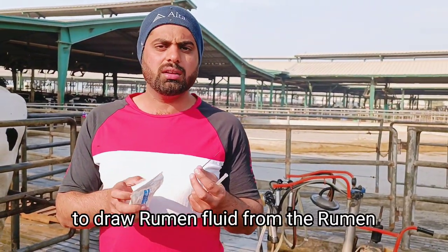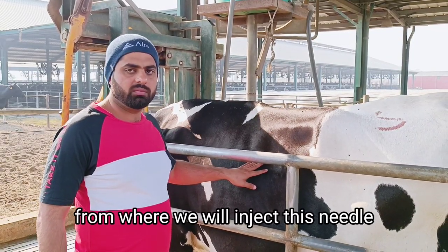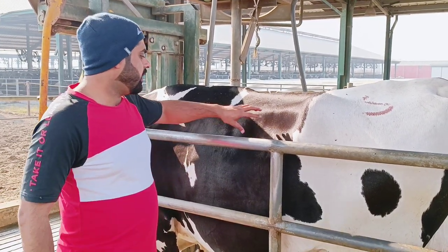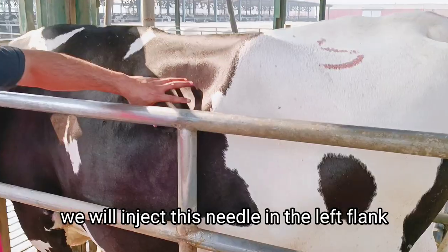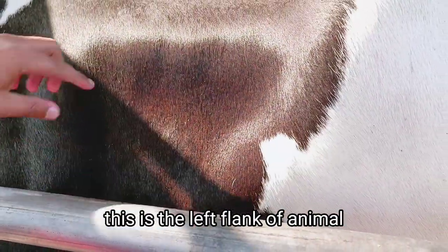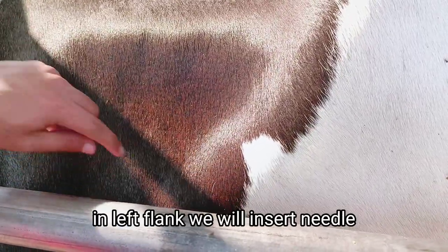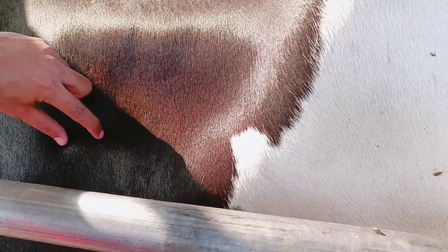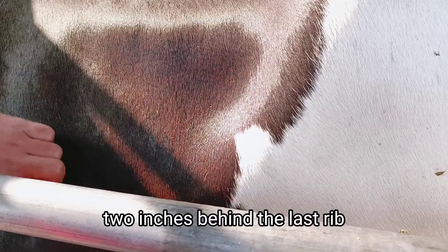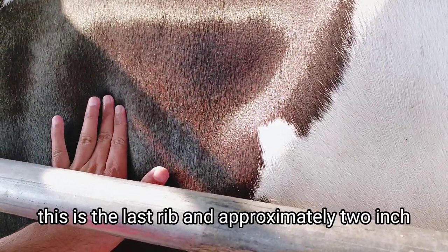I will show you the side from where we will inject this needle. We will inject this needle in the left flank. This is the left flank of the animal — we have the rumen on the left side. In the left flank we will insert the needle two inches behind the last rib. This is the last rib, and approximately two inches back we will inject the needle here.